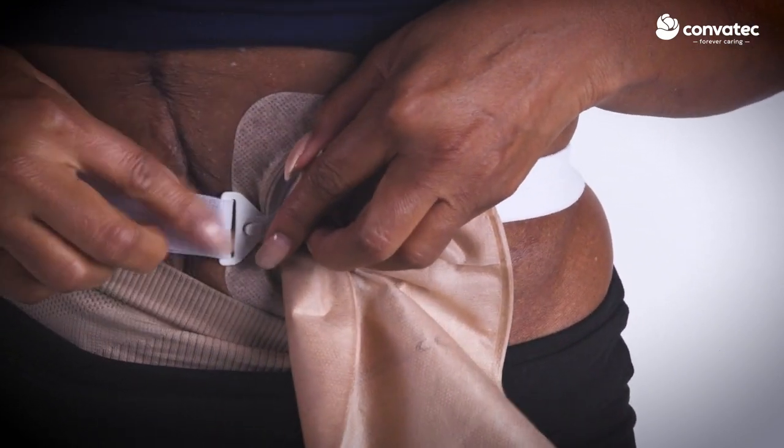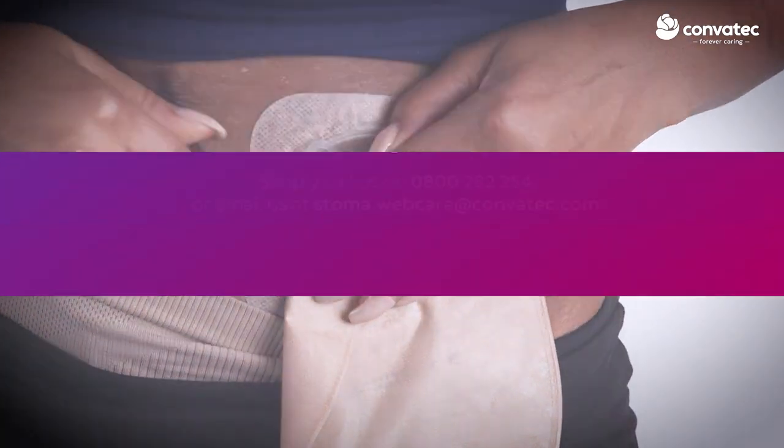Once the belt is attached to the belt tab, pull the belt again to confirm that the tab is secure.